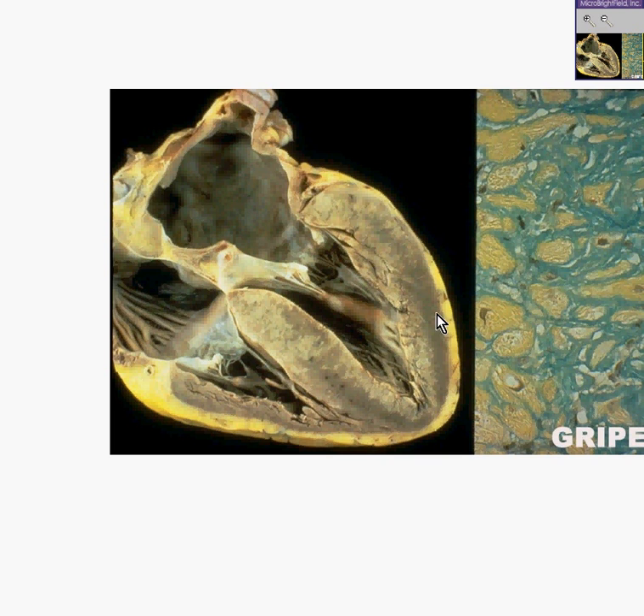Notice that it's not normal. Notice how thick the left ventricle and septum is, and even the myocardium in the right ventricle is thicker than it should be. Normally the right ventricle should only be about 4 millimeters, and the septum shouldn't be more than about 1.5. This is a very thick, bulky myocardium, and you could see that it is not uniform — you have some brownish areas, but also more yellowish areas as well.